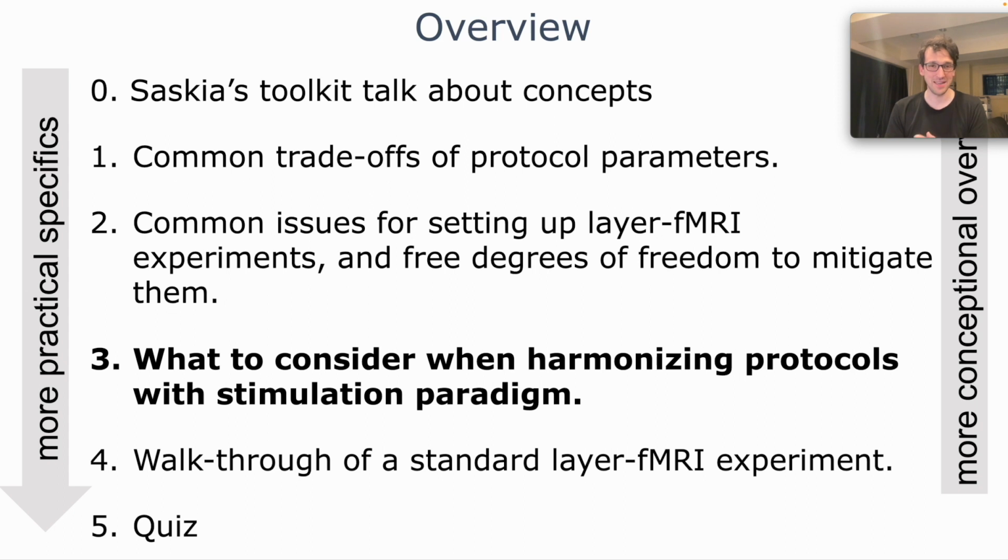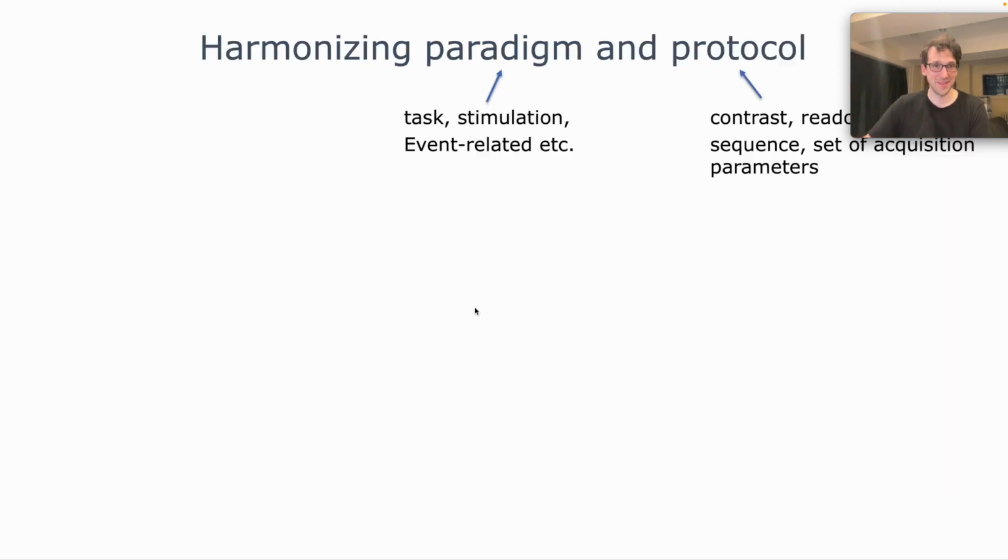And that's a limit in layer-dependent fMRI, to find out what works and how we get this together with the neuroscience. So now I would like to show you a few examples of how you can harmonize your paradigm and your protocol from my experience of the last few years.